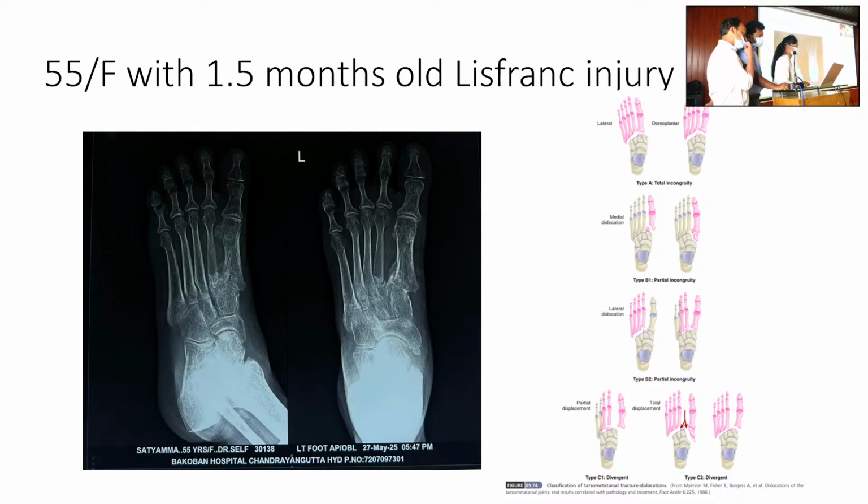So do you think this fracture is to be operated or can we just leave it like that, put a cast and make it move? Since it's unstable, it's a divergent fracture. You can see the Lisfranc fracture also, that's the ligament. Metatarsal also is involved. It is not at the joint but at the base. Yes. That is the difference.